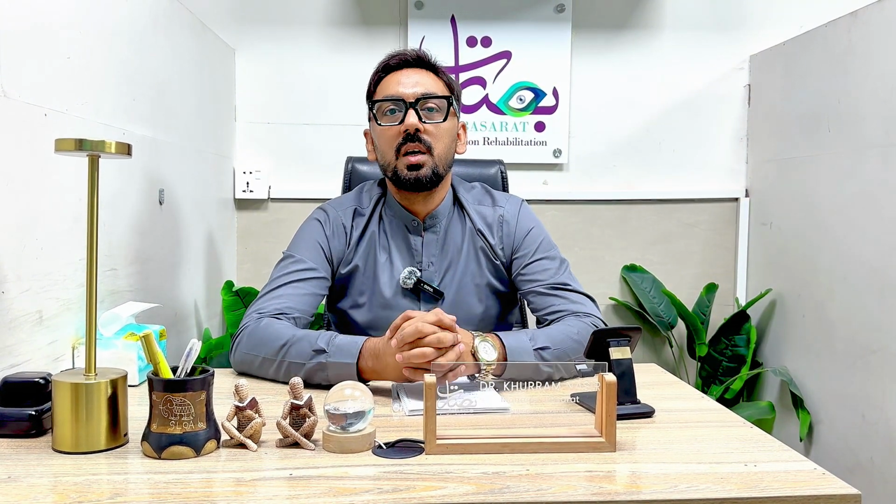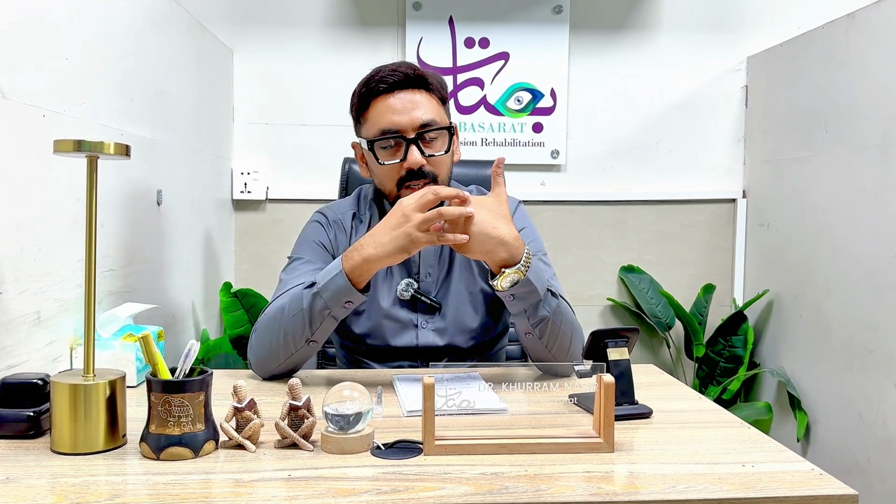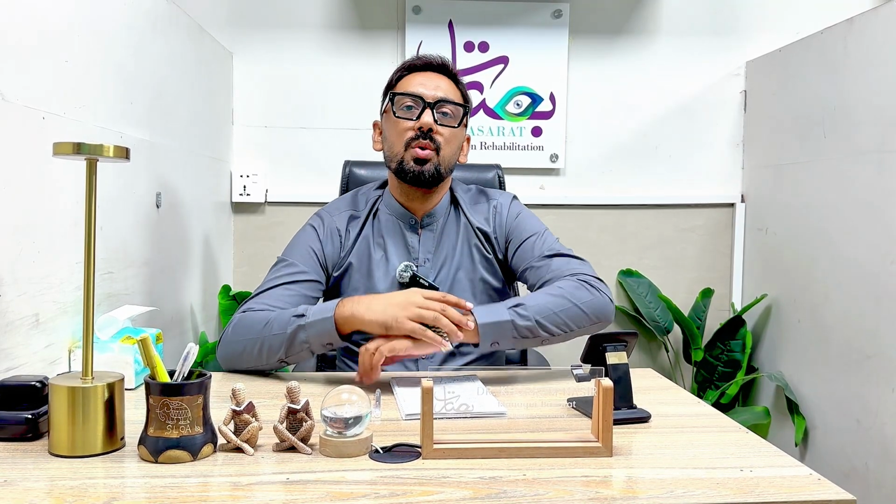You know that RGP lenses are very small in size as compared to soft lenses or scleral contact lenses, right? Because the RGP lenses have to fit at the central portion of the cornea, not at the scleral portion or the peripheral cornea, right? So it will treat the irregularities of the cornea.